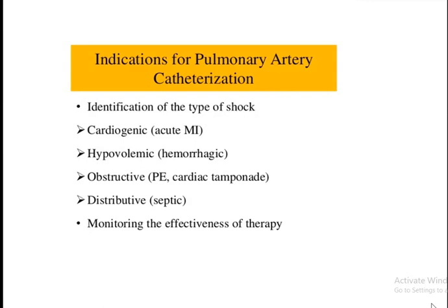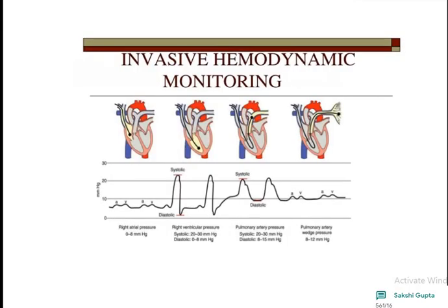As I have already told you, the indications are to identify the type of the shock, whether it is cardiogenic, hypovolemic, obstructive, or distributive, and monitoring the effectiveness of the therapy.